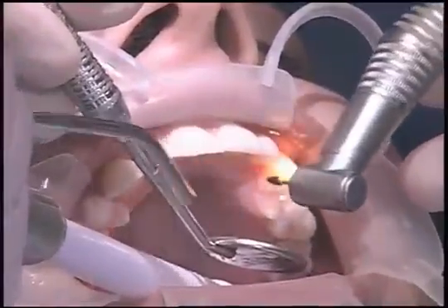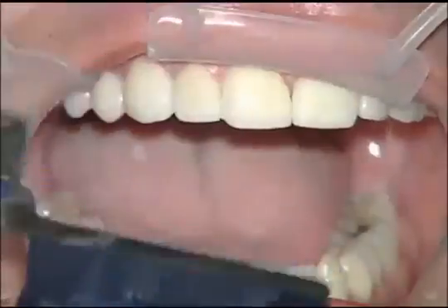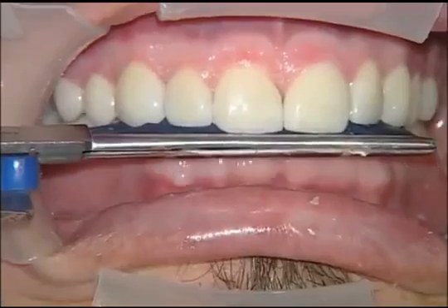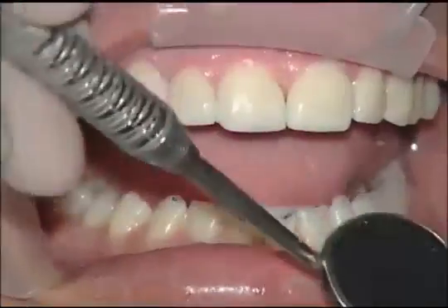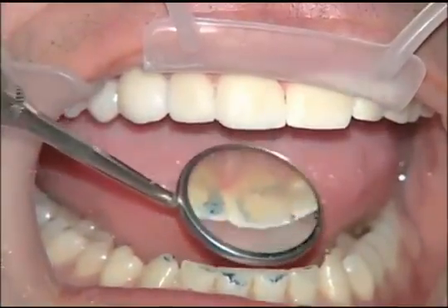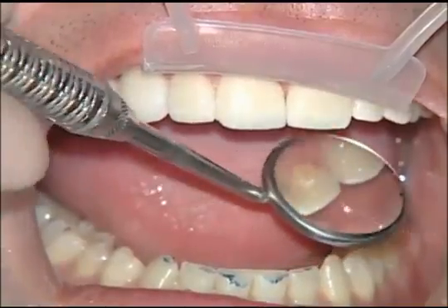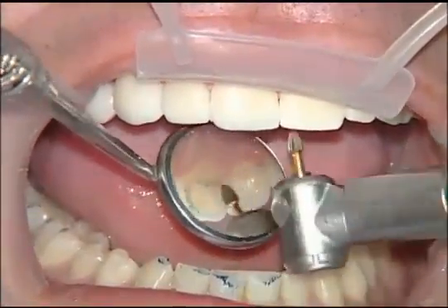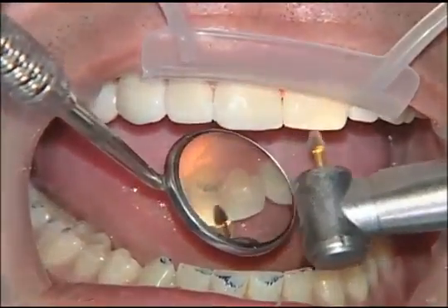When we finish smoothing everything off on the lingual, the next step is to use our articulating paper to go in and see if we have any prematurities. Actually, what happens more commonly is we have some excess cement left over. When you use a translucent resin cement, oftentimes you'll have excess resin cement that you didn't see on a tooth, and that ends up being your high spot.